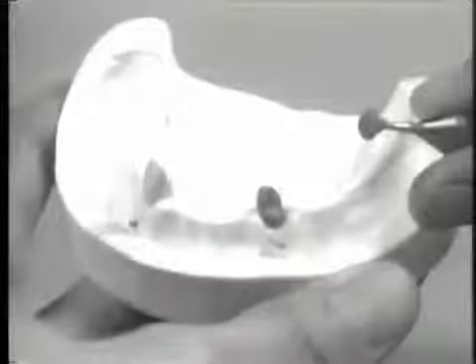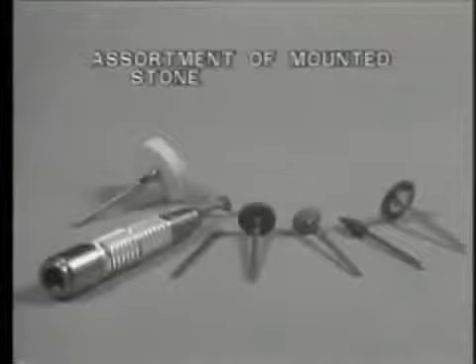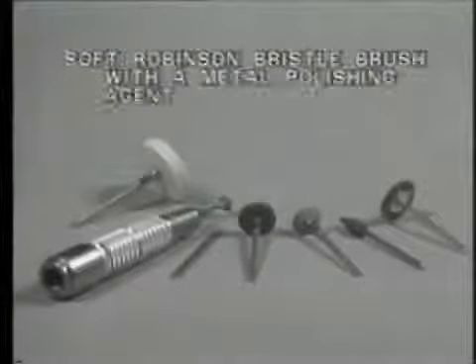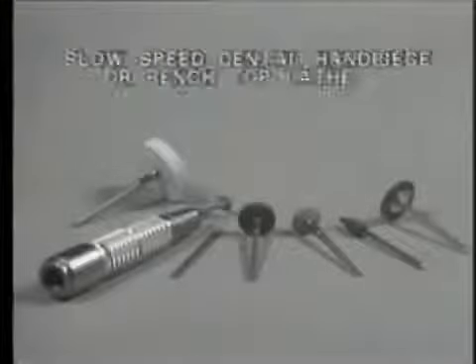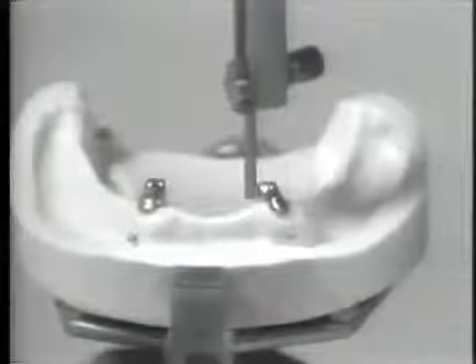Now that the high coping has been cast, standard finishing and polishing procedures are followed to complete the raw casting. After cleansing and pickling, the finishing and polishing sequence uses: an assortment of mounted stones, a number 8 finishing burr, an assortment of sandpaper discs with a mandrel, a series of abrasive rubber wheels, a soft Robinson bristle brush with a metal polishing agent, a chamois wheel with rouge, and a slow-speed dental handpiece or bench top lathe. The completely finished and polished copings are finely inspected for fit, marginal integrity, and parallelism. The copings are now ready for cementation and the final impression procedures for overdenture construction can be initiated.